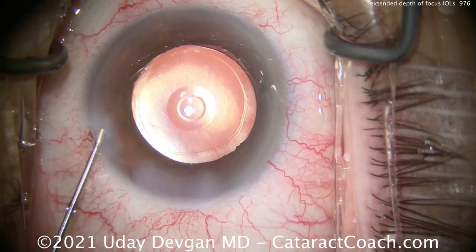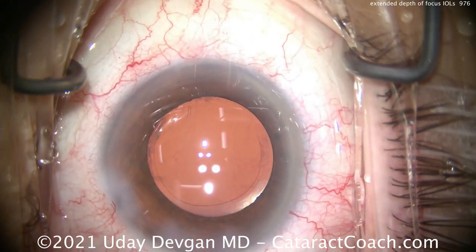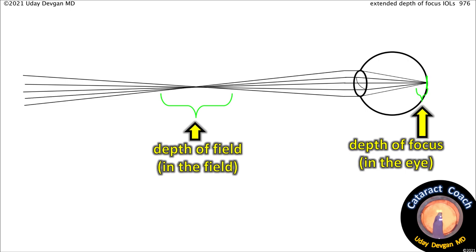Let's talk a little bit about the optics of this lens — the optics of focusing. Ophthalmologists frequently use these two words interchangeably: depth of field and depth of focus. They're actually different. Depth of focus is within the eye; depth of field, as the name sounds, is out in the field. When we talk about depth of focus, the patient is more interested in the depth of field — they want to know what range they'll be able to see without glasses. This extended depth of focus lens does increase that depth of field, giving patients an increased intermediate zone. Instead of having a near point of about a meter, that's brought in to about 60 centimeters or so.